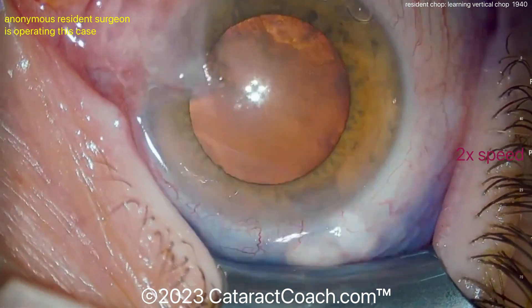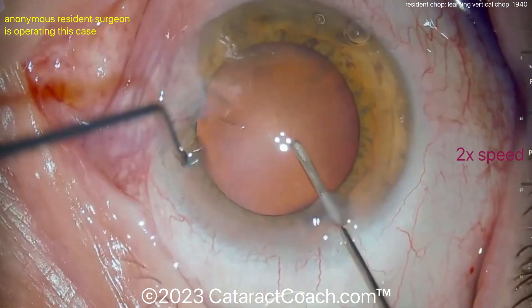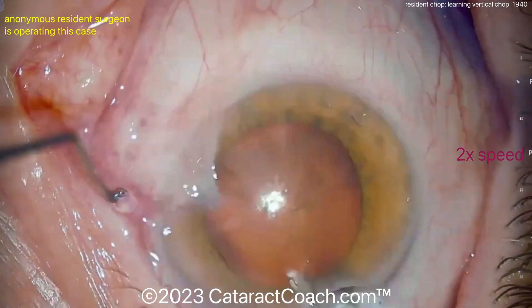Now that main incision — look at it. It got stained by the blue dye. It's too avascular; it's not nicking the limbal vessels at all. So I need you to revise that incision. Next time, do a better incision.